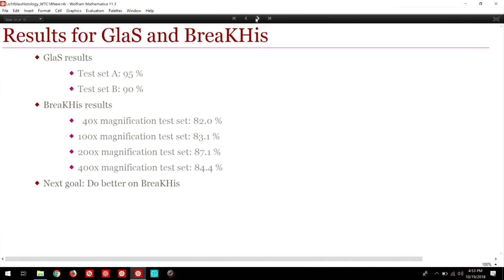That's not bad. And most misses are off by one. The bad news is there was one person who was perfectly healthy who got a grade 3 report, and you can die of a heart attack as easily as cancer, so maybe that wasn't such a good thing to tell that poor patient. But there's room for improvement. As confusion matrices go, that one has a lot of values that are either 0 or very close, and most of the mistakes really were between level 1 and 2, and level 2 and 3.